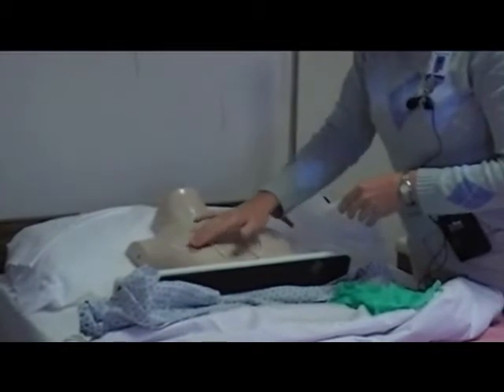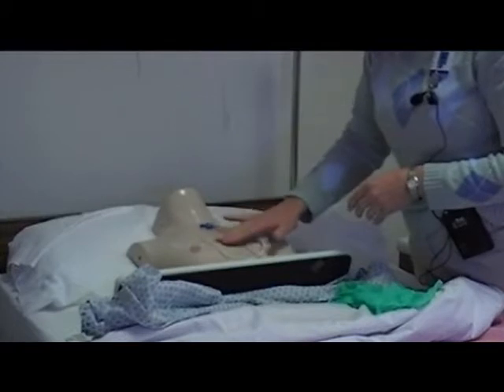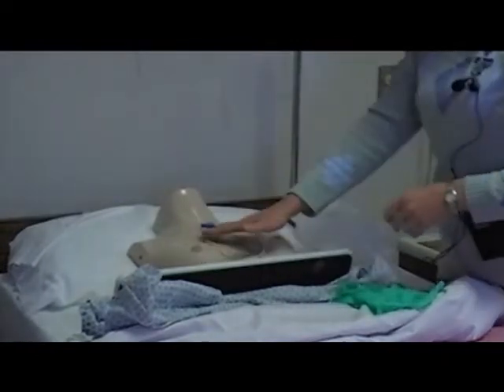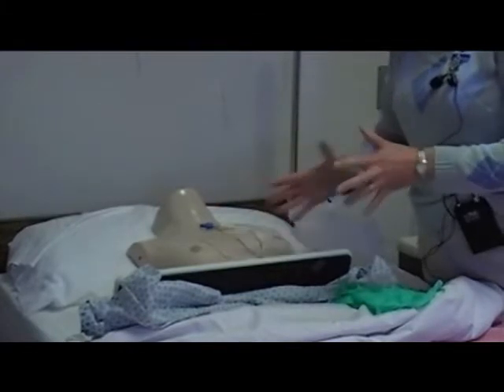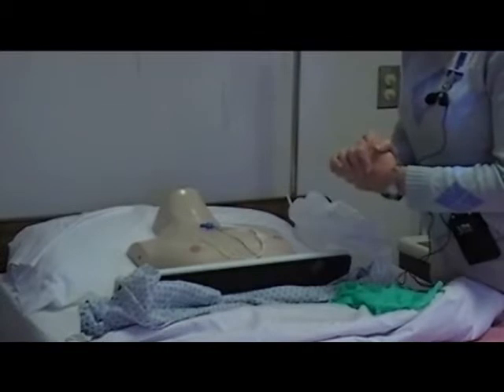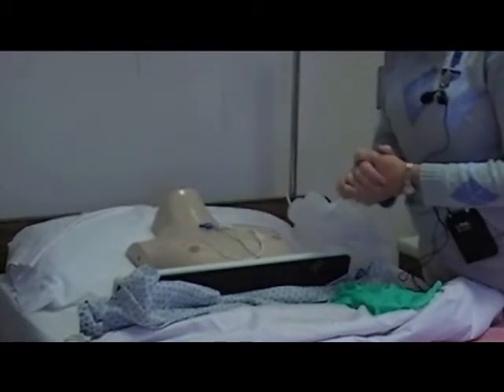I'm going to feel the area. Does it feel warm? Does it feel cold? Does it feel mushy or kind of crackly, like Rice Krispies under his skin? Because if that's the case, I may have an infiltration issue. I'm going to compare side to side here when I look at his chest. It's not like a hand that you can easily look at and see swelling. In a chest, in some individuals, you won't really be able to see swelling unless it's gotten very extreme. So you need to compare. Do they look symmetrical? They look fine. When I feel, he has no discomfort, it doesn't hurt, and there's no drainage.